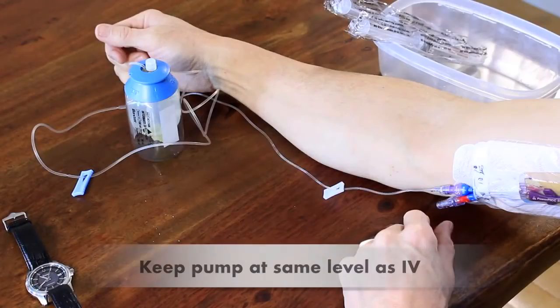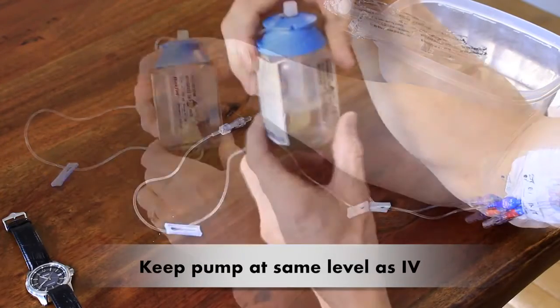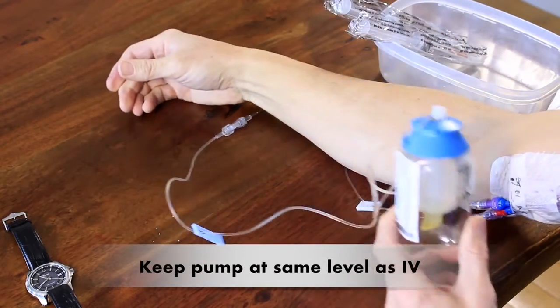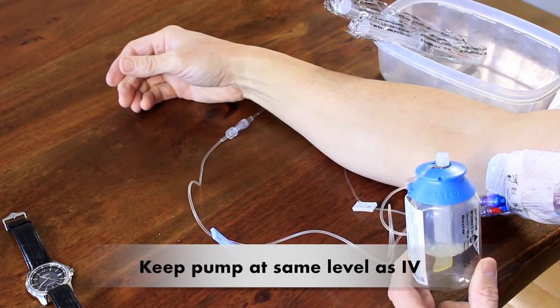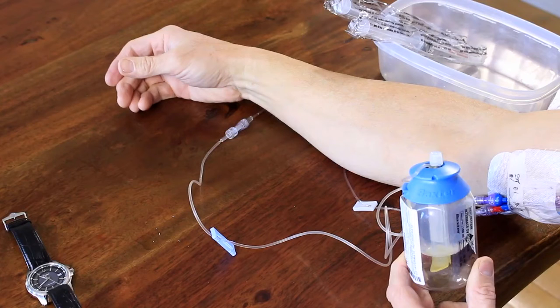Now, to make sure it runs at the right speed, you need to keep the pump at about the height of your IV site, so around the height of your chest. You also need to keep the bottle out of extreme temperatures, so out of heat or out of the cold. If it's the winter, you would carry it inside your clothing if you had to go outside. And if it's warm out, keep it out of the sun.